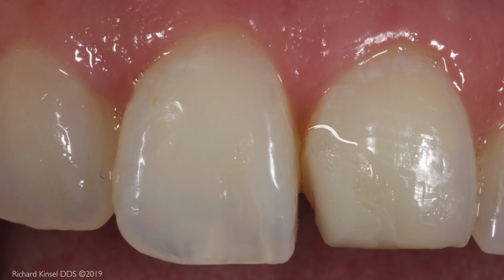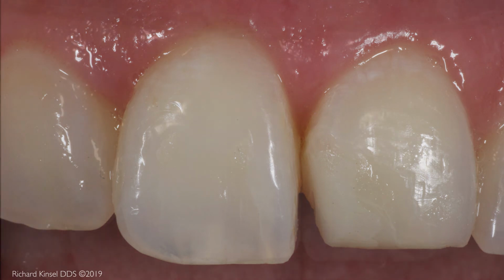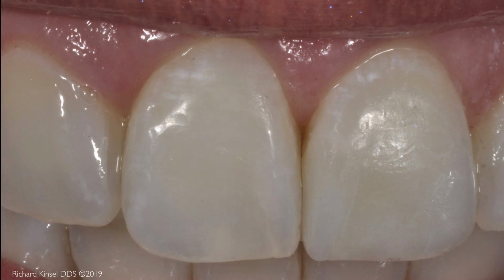The wavy margin hides the junction of the porcelain to the natural tooth. This is the result following enamel bonding of the partial porcelain veneer. Notice that the edge of the porcelain blends into the adjacent tooth structure.